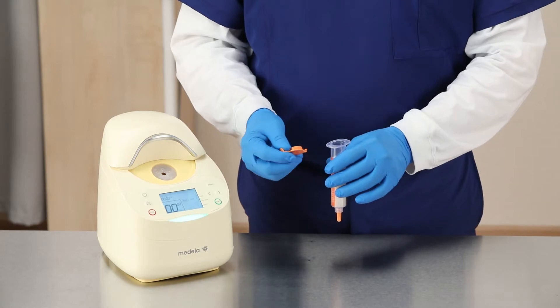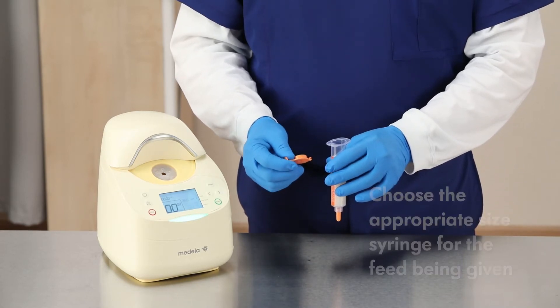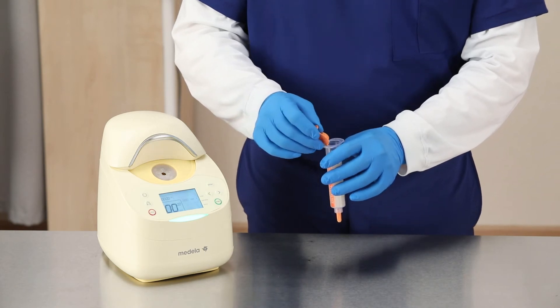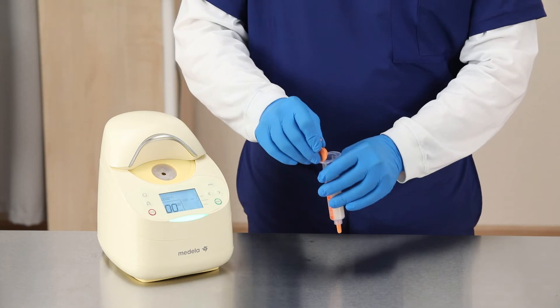For feeding, prepare the feed normally with the correct volume syringe. Remember to choose the appropriate size syringe for the feed being given. Attach the Gravifeed lid by pushing the clips into the notch on the syringe barrel.